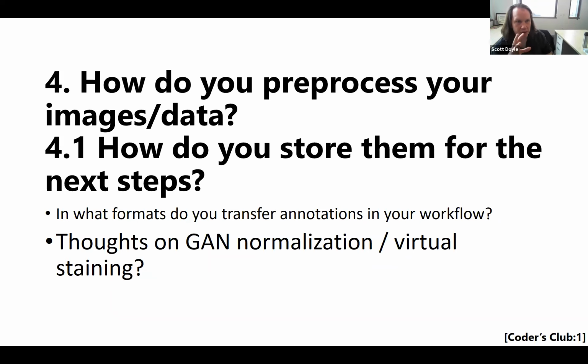You could get around some of the computer vision stuff like differences in staining, differences in contrast, right? That's fine. But I'm skeptical that if you have, for example, a tumor grade that you're trying to run inference on that is not present in your training set, I don't think that the addition of GAN is going to help recognize that structure. And I'm 100% open to being wrong about that, but I would need to see the experiment.